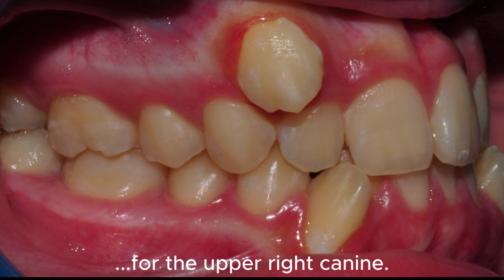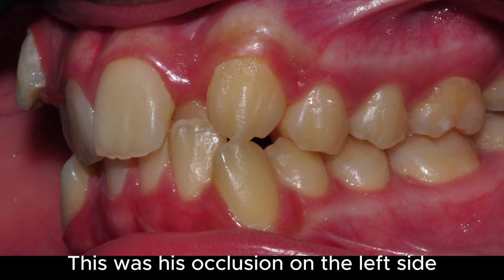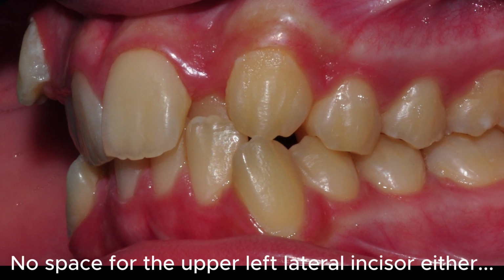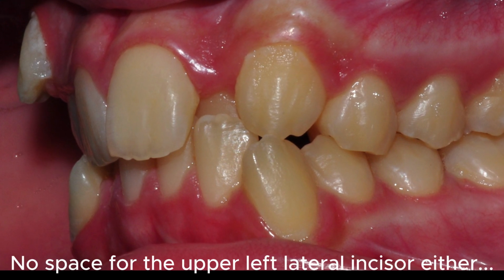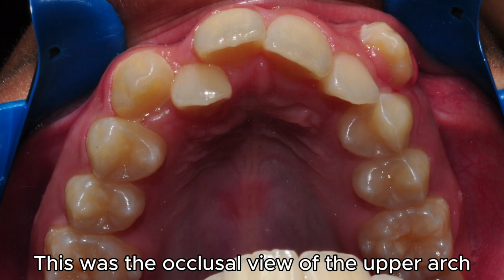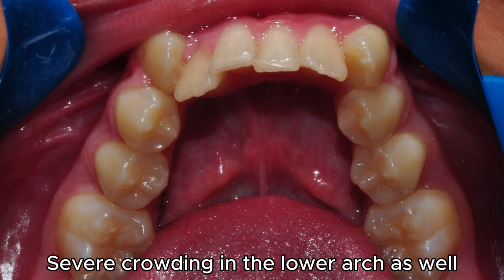upper right canine. And this was his occlusion on the left side. There was no space for the upper left lateral incisor either, which was palatally blocked and in crossbite. This was the occlusal view of the upper dental arch. He also had severe dental crowding in the lower arch.